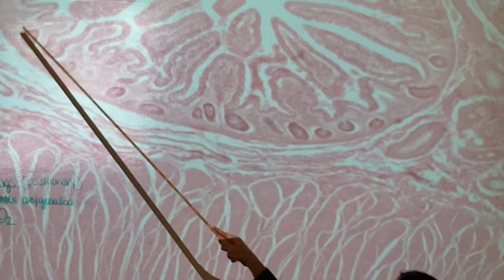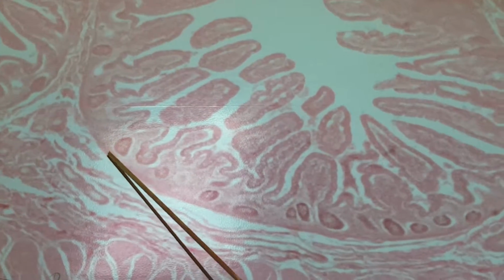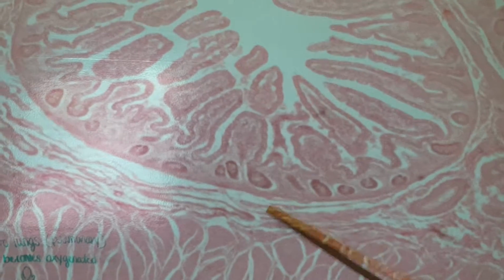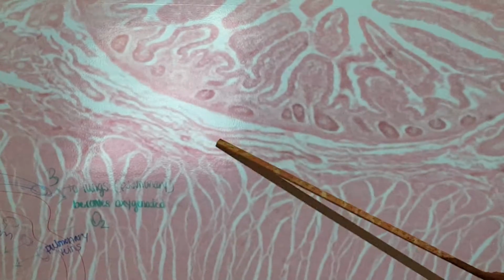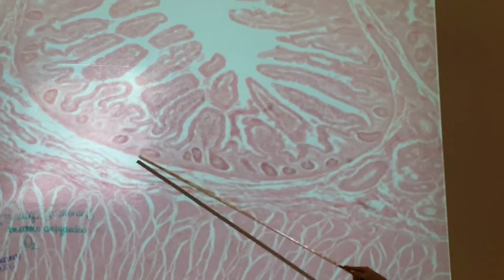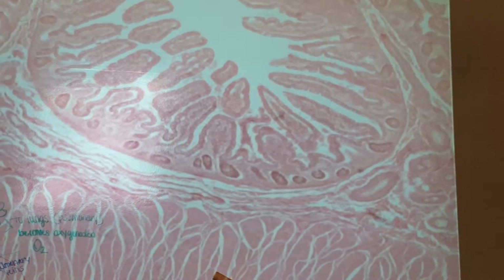Intestinal cells, or intestinal glands. And then the very bottom of that would be your muscularis mucosa right here. This layer, submucosa. What was this whole layer right here? Nope, the whole layer. Sorry. Mucosa layer. Mucosa, submucosa, muscularis externa.